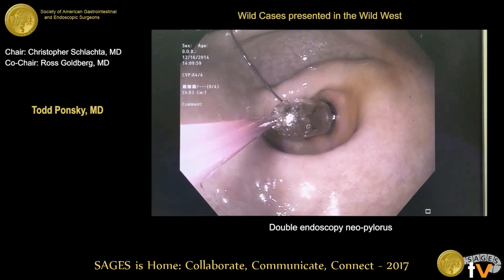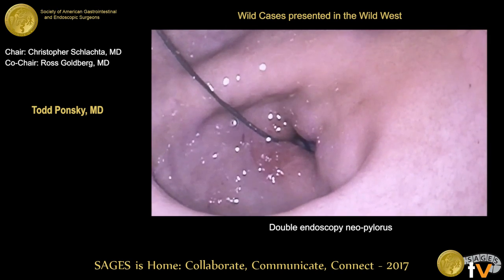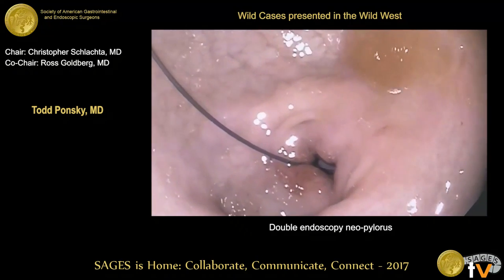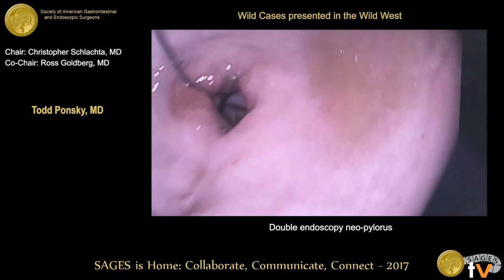The patient recovered remarkably well. After the first follow-up endoscopic dilation, he was eating a regular diet and had no retained food products in the stomach. He was no longer reliant on his GJ tube for drainage or feeding. At the latest endoscopy, the pylorus was entirely mucosalized and widely patent.